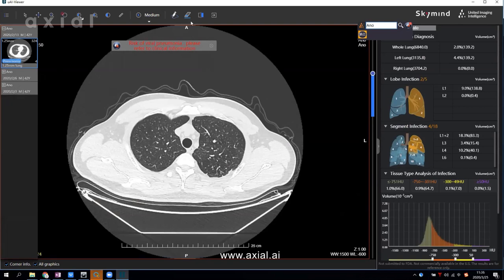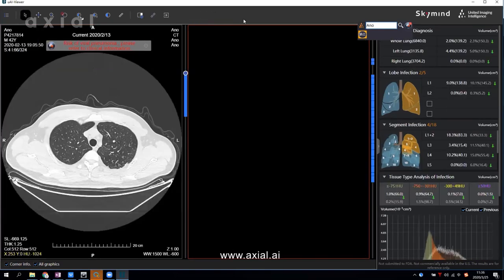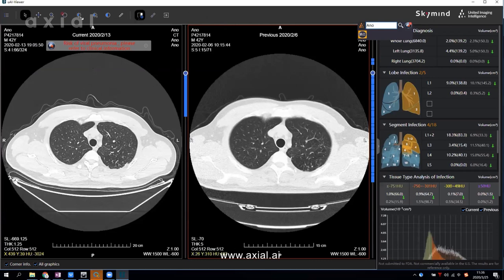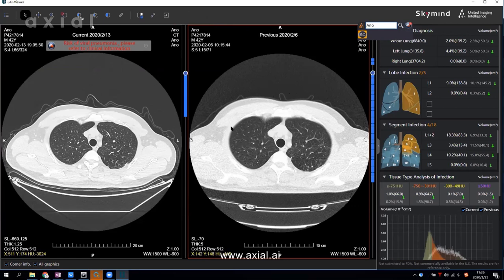Then you click 'Run Follow-Up' and it will compare the current report with the previous report. You can see the left side is the current report and the right side is the previous report. In this case, you will find that the blue color bar — which represents the infected slices — is reduced, meaning the infected region has decreased compared to the previous report.